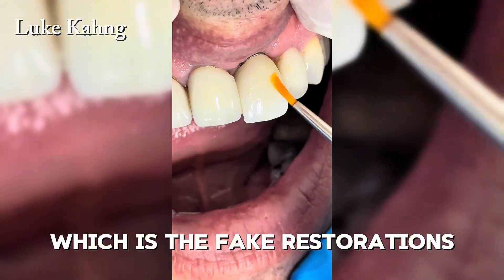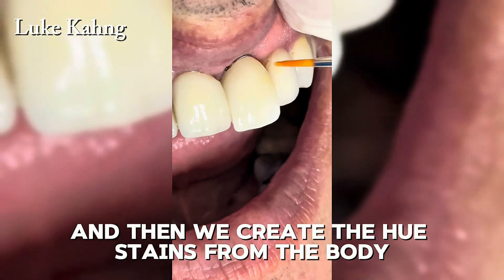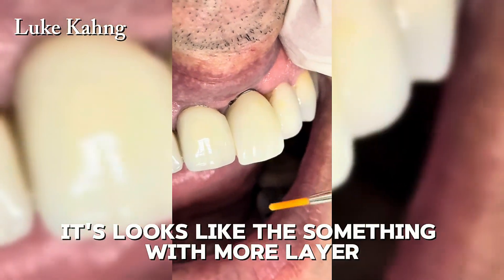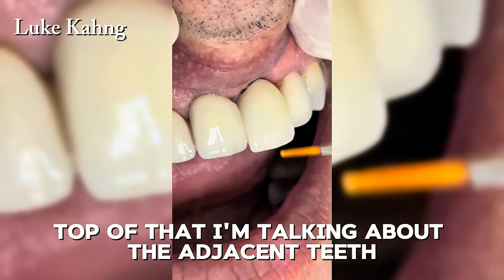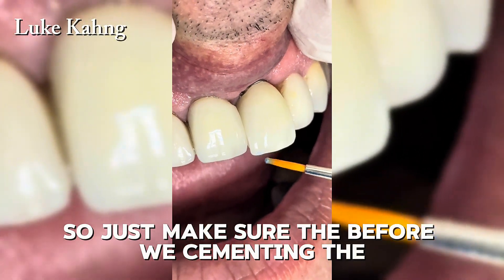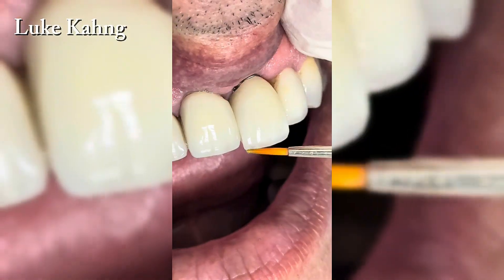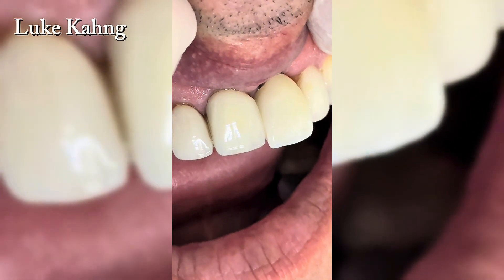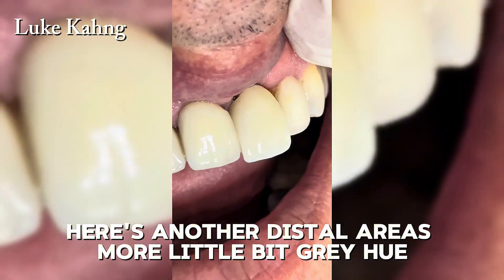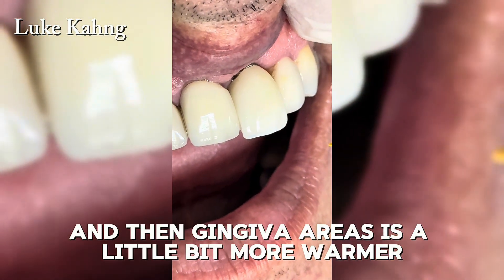Making sure the adjacent teeth — which are fake restorations — are matched. We created hue stains from the body and gingiva areas so it does not look like a shade tab; it looks layered. The final restoration has enamel translucency compared to the adjacent teeth. In the distal areas there is more of a gray hue, which creates another translucency, and the gingival area is a little bit warmer.